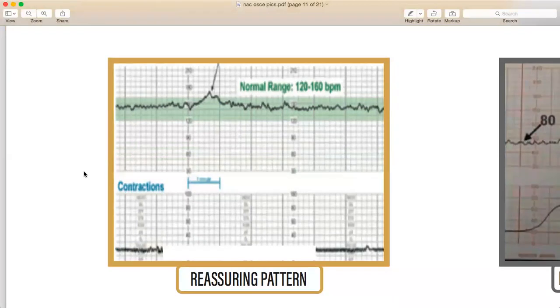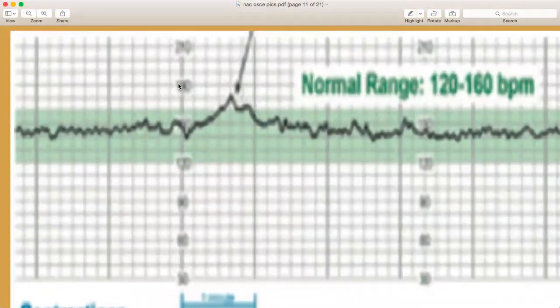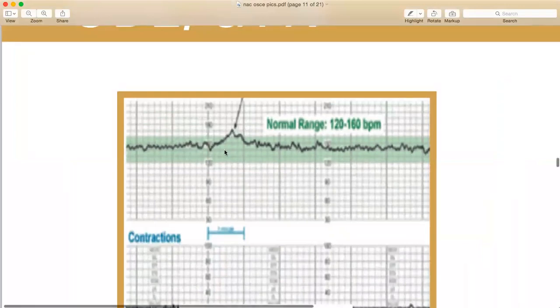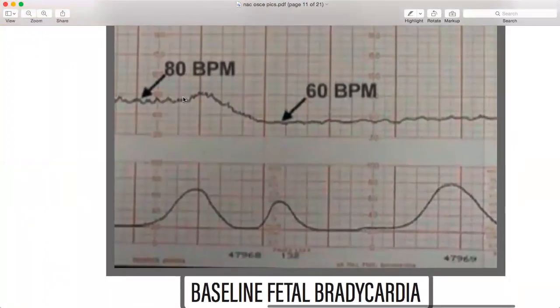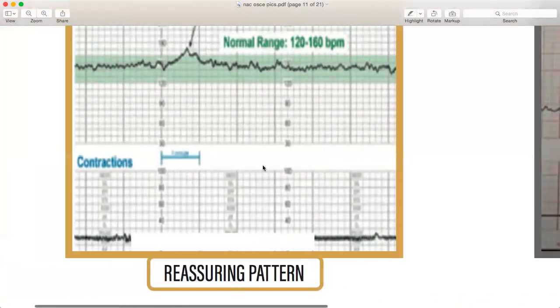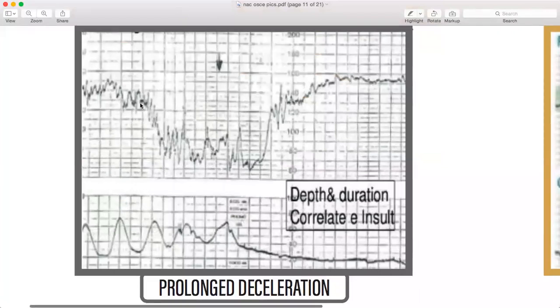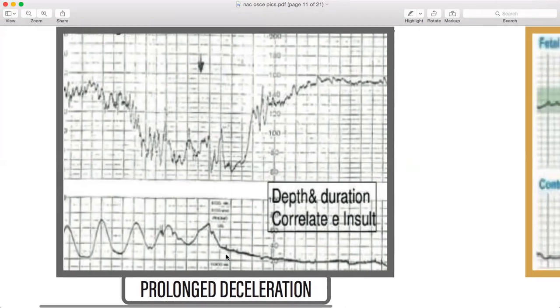This is a reassuring CTG pattern where the normal fetal heart rate range is 120 to 160 bpm and is within range. Then fetal bradycardia — the rate drops to 80 or 60. Then prolonged deceleration — going on for a long time, where the depth and duration correlate with the insult. This is likely uteroplacental insufficiency.